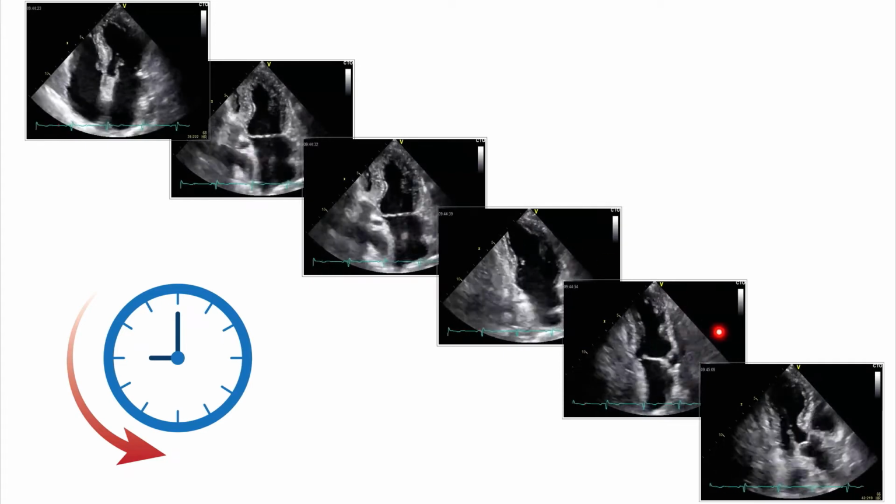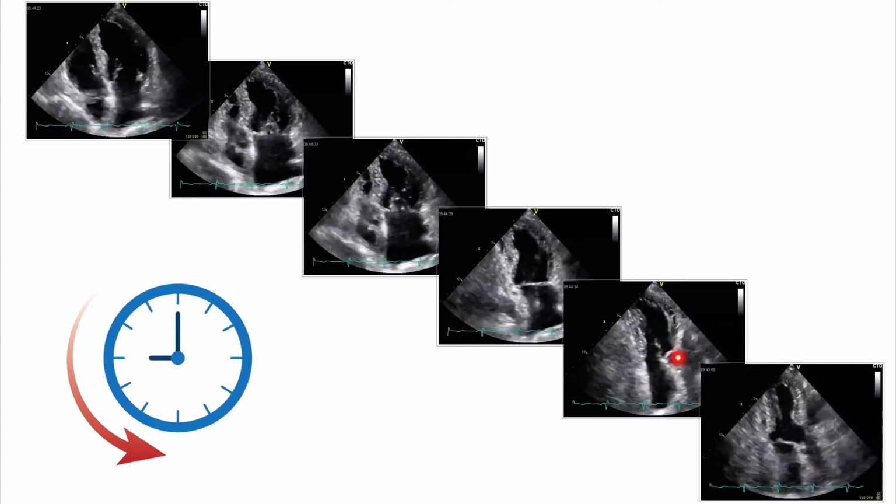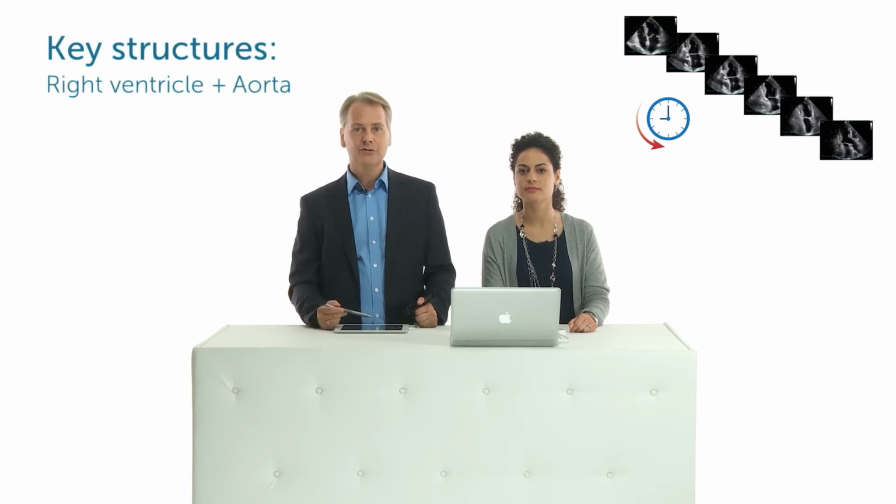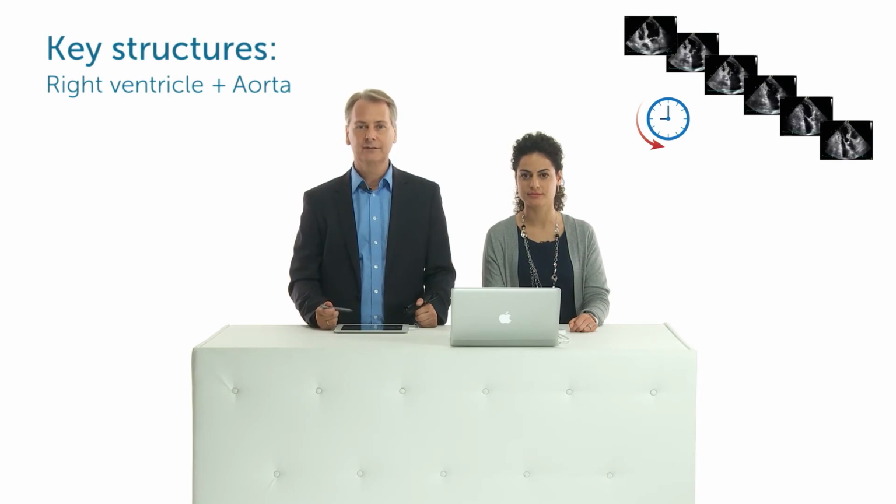And then when on the other side, all of a sudden, the aortic valve starts to open, that's when you get into the 3-chamber view. Now, I know there's different angles which you read in textbooks, but nobody is going to look at angles when they rotate. You can look at the image. And these are the key structures you have to keep in mind when you do the rotation.